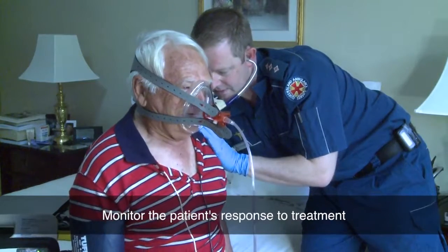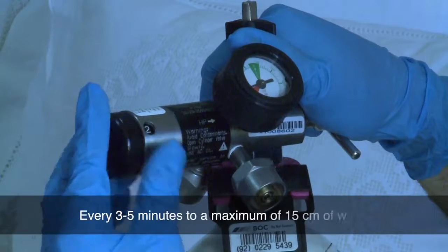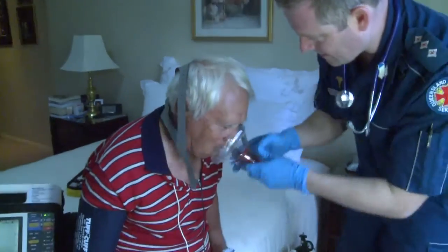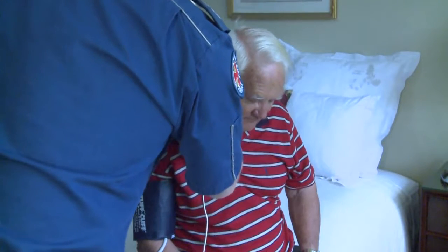Monitor the patient's response to treatment, specifically their respiration rate, SpO2, blood pressure, chest sounds and work of breathing. If appropriate, increase the airway pressure every 3 to 5 minutes to a maximum of 15 centimetres of water. If the patient shows any evidence of deterioration or vomits within the CPAP mask, it is to be removed immediately and the patient treated in accordance with the appropriate CPG.